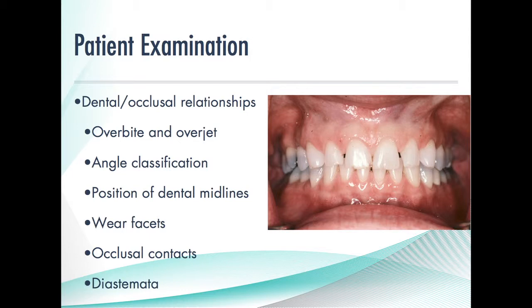So we do our patient exam. Do they have teeth? Obviously, we look at the midline. We want to make sure things don't change, and maybe in 5-10% of the cases they will change. So we take photographs on everybody, and we have study casts. And we look at how their bite is, and do they have any spaces between their teeth?